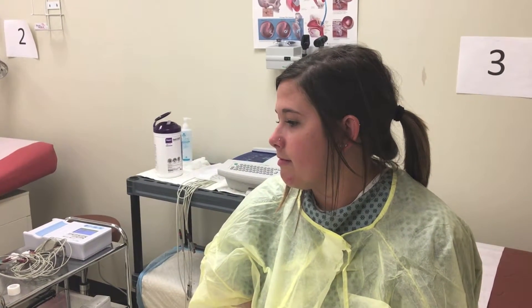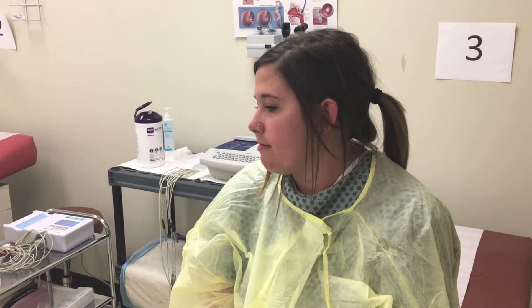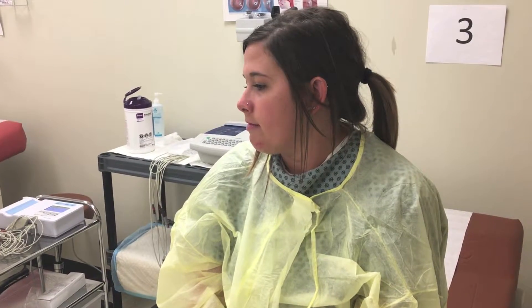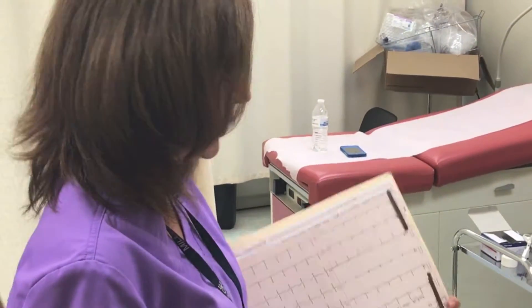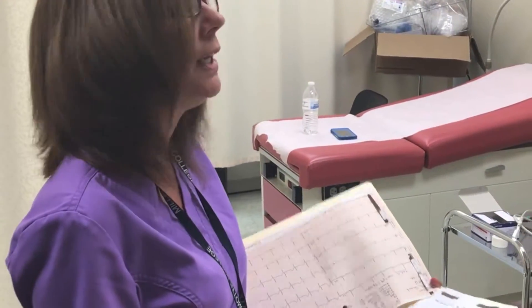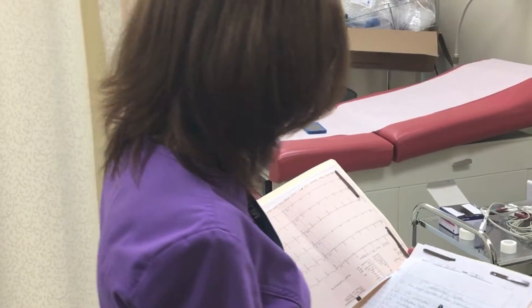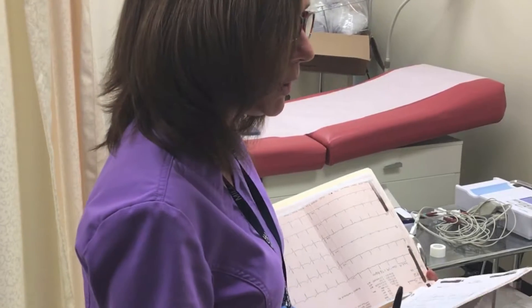Prior to the ECG procedure, the patient will be instructed to remove her clothing and place on a gown for the electrode placement. Hi Ms. Matthews, my name is Marjorie and I'm an MA here in Dr. Conway's office. She has ordered an EKG. I've already explained that you needed to get into a gown, so I'm going to begin by placing some electrodes on you.